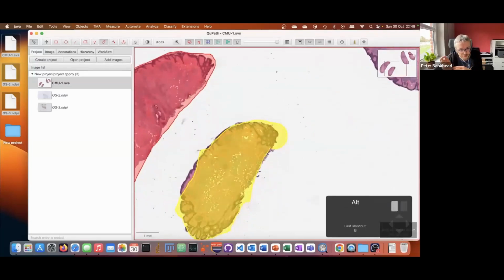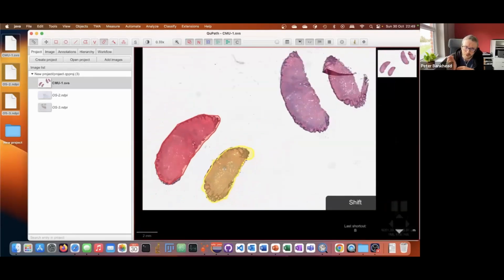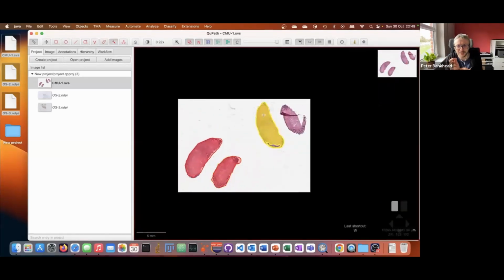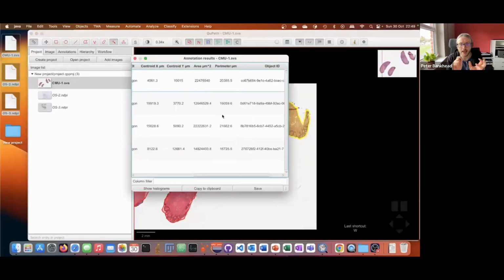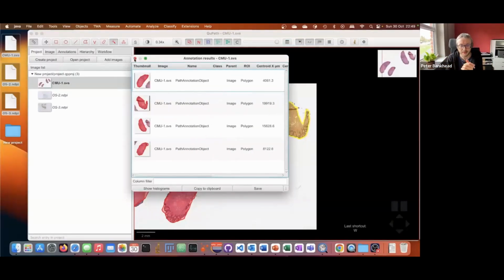Initially I used QuPath's Polygon tool to draw. Now I'm using the brush tool. I'm not doing it very well because I'm in a rush trying to hit the 3 minutes. But then it gets a lot faster when I switch to the wand tool. QuPath's wand tool is completely different from ImageJ's wand tool, but it's a very efficient way to annotate quickly.